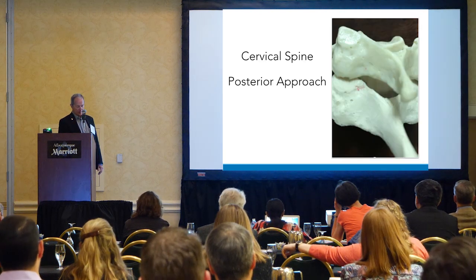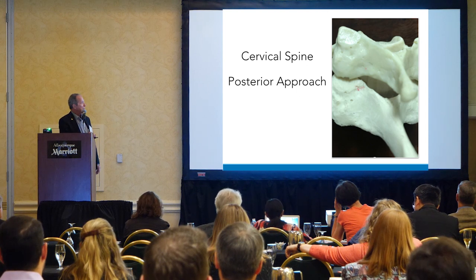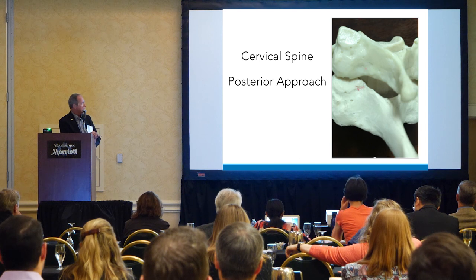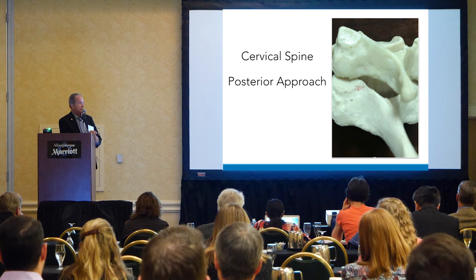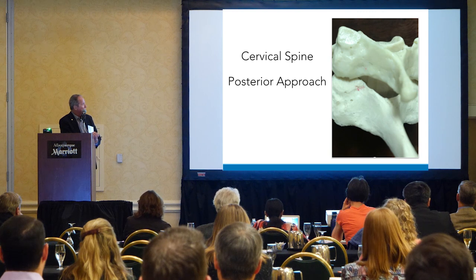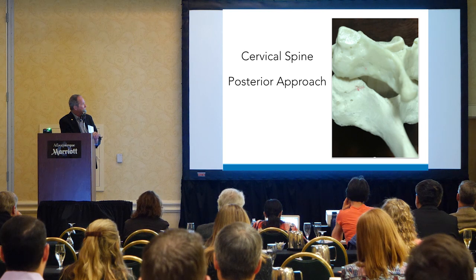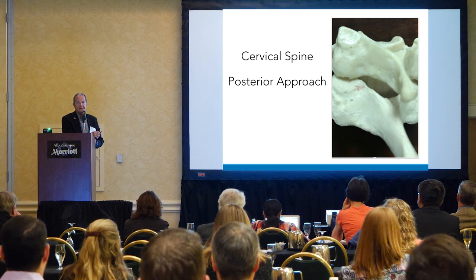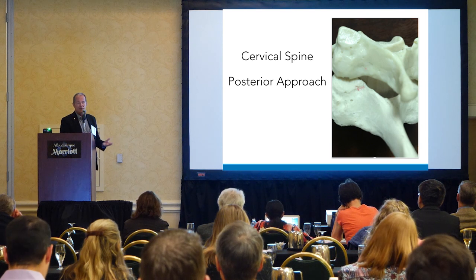I want you to take note here. This is the approach, this is 6-7. What we're going to be trying to do in this whole procedure is just lateralize the interlaminar space. It's going to start like this. We're going to be up in here, going to the lamina of 6, and we'll see the facet joint. Then we're going to thin out this section here. We're just extending the interlaminar space laterally. That's really a lot of the operation, just thinning the bone. So at the end, when you lift off the remaining portion of the bone, you're going to see the exiting nerve root.